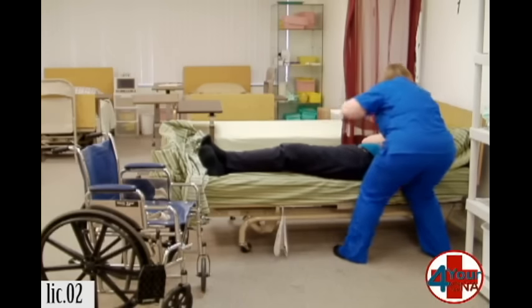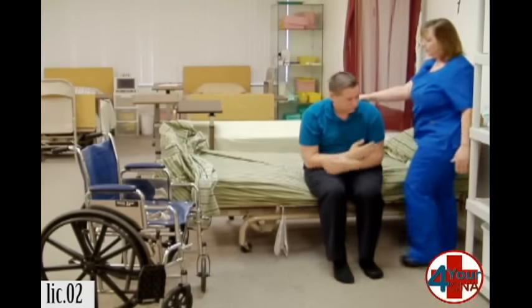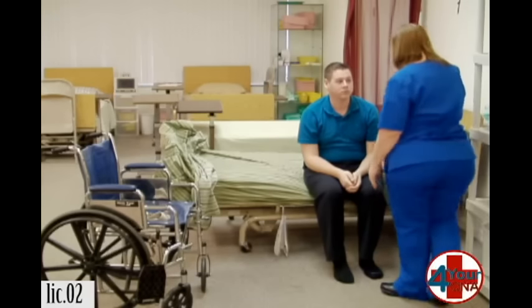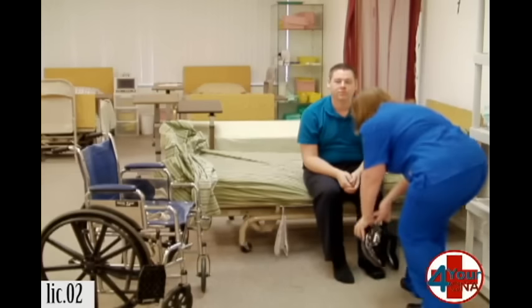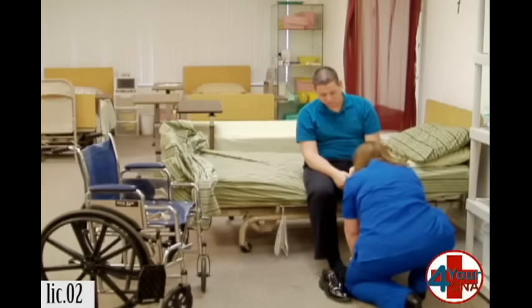Can you cross your hands over your chest for me? Feel okay? Yeah. Dizzy at all? No. Okay. I'm going to put your shoes on. Here we go.